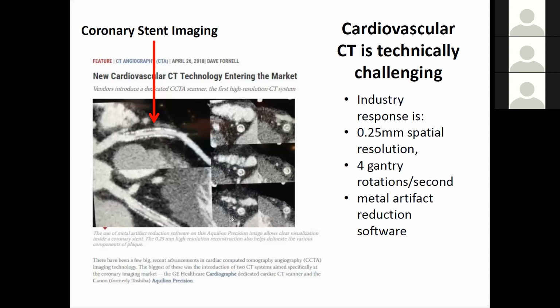And the starved lines of response require in-painting. It's preferable to not do in-painting if you can avoid it. In-painting is a branch of limited angle, basically, and so anything like that is less robust. But if that's what you've got in your data, that's what you've got. But dual energy does help a lot with metal artifact. Again, there's a good literature on that.